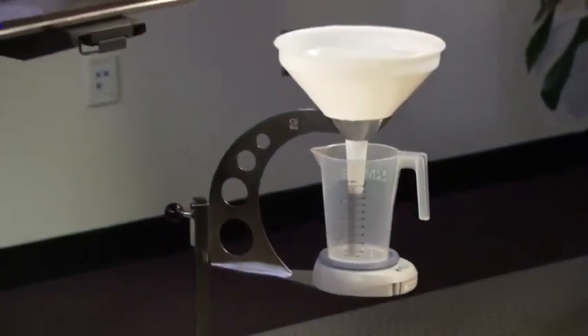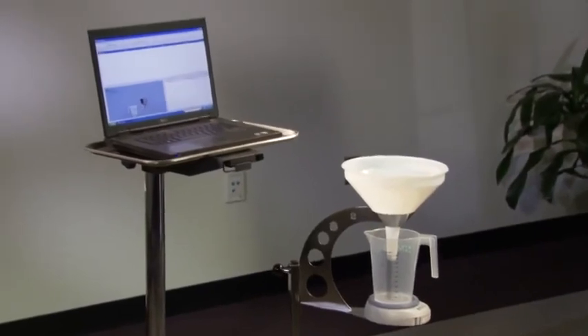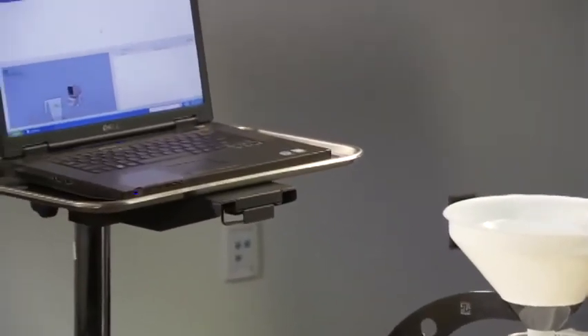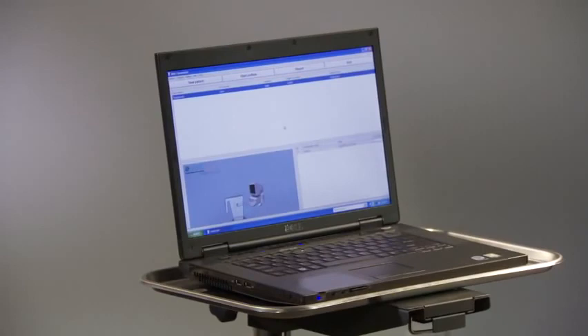In addition to the SolarBlue, Medical Measurement Systems also offers a standalone uroflow system called the Flowmaster. The Flowmaster utilizes software that connects to any Windows-based computer and lets the technician perform uroflow studies, communicating via wireless Bluetooth technology, allowing the patient to void in a comfortable and private setting.